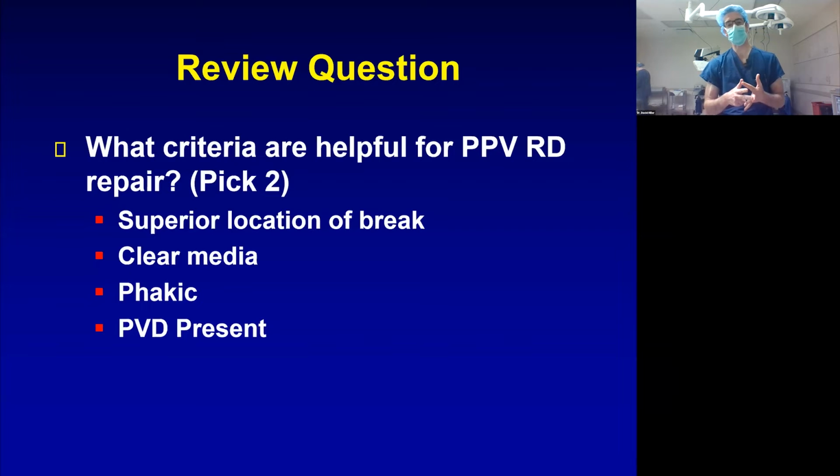And phakic is never really a help. Phakic is basically a more negative. It's a negative indicator for vitrectomy surgery for retinal detachment repair.